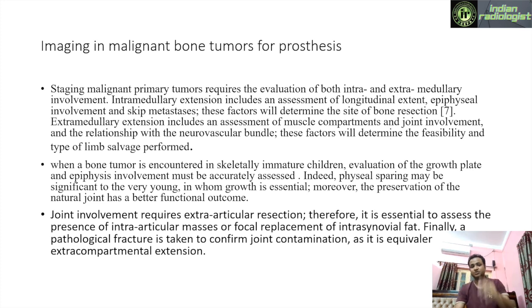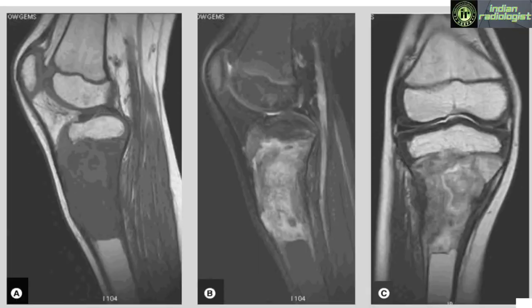A pathological fracture is taken to confirm joint contamination as it is equivalent to extra-compartmental extension. As a startup example, this is an Ewing's sarcoma in a 10-year-old boy where the STIR sequence shows the medullary extent of the lesion. In the coronal image, owing to the contrast between the growth plate and the tumor, we can see epiphyseal involvement, which should always be accurately assessed since it influences surgical strategy.